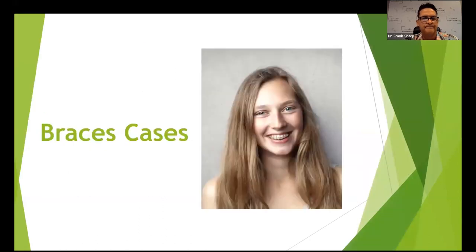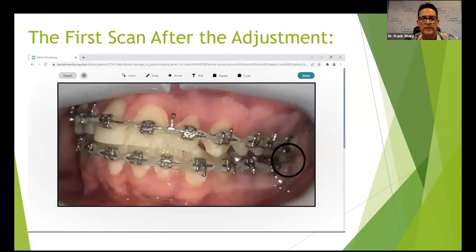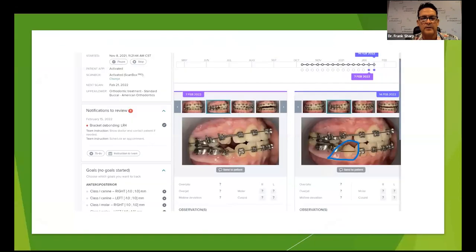For our braces cases, just a quick thing to point out, I'm a big hands-on guy, like I said, and I want people to understand it's about what works in the clinic for me. I don't care so much about statistics and all that good stuff and looking at how things are evaluated. I want to know what works for me in the clinic. And so that shows you one week, following week, the wire is out of the lower left seven. We called, we had them come in, we fixed it that day, and we keep on moving.